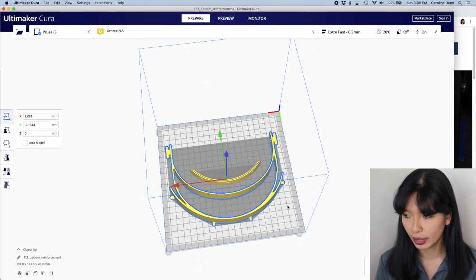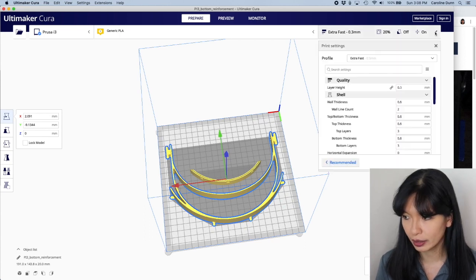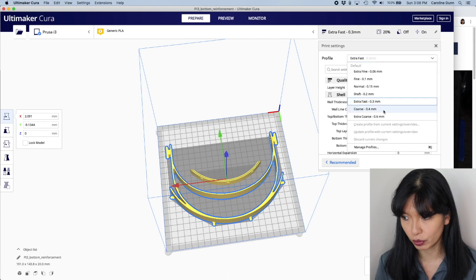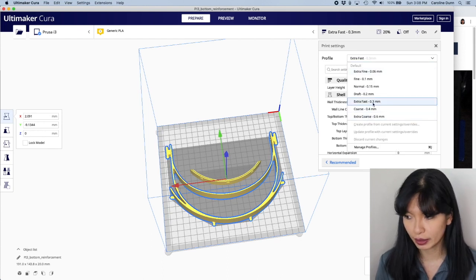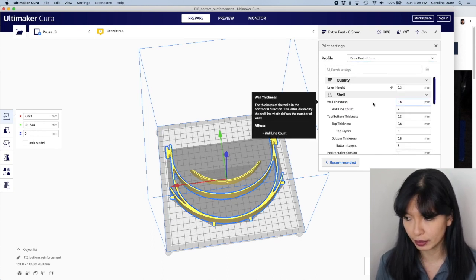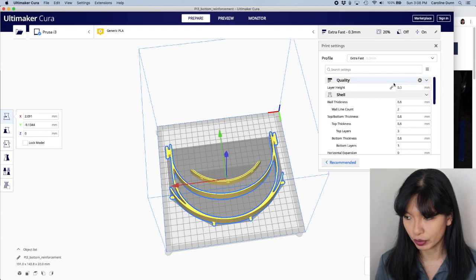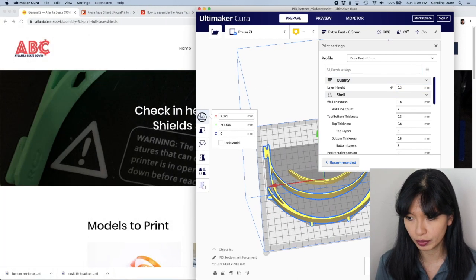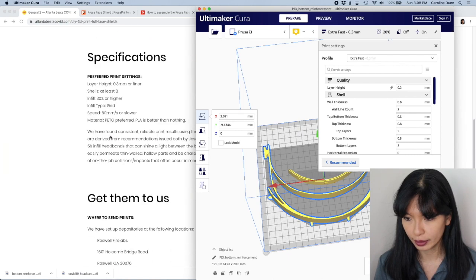And so here's one full print right here. So this is one shield. I'm going to hit the little pencil icon and I'm now going to go through the settings. You have these default settings. I'm going to set mine to extra fast. And then I'm going to look at the requirements based on the ABC website.